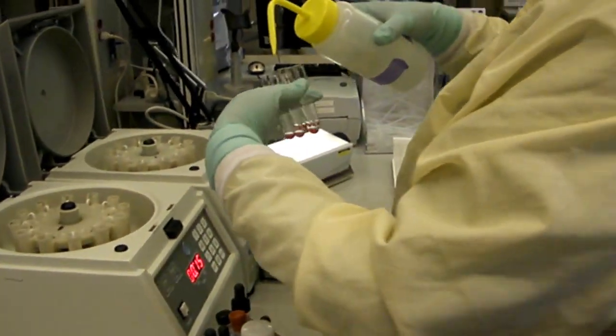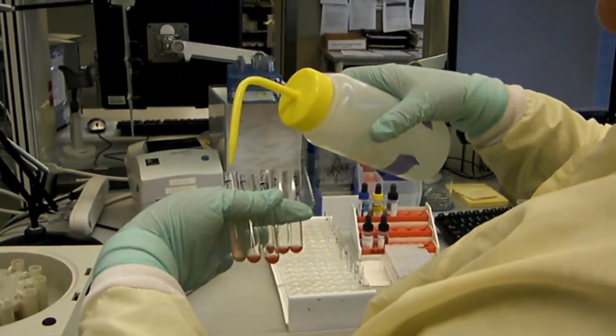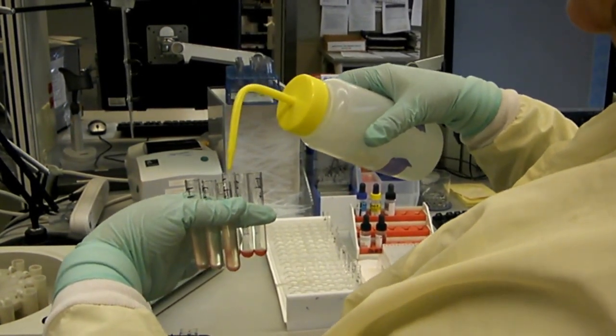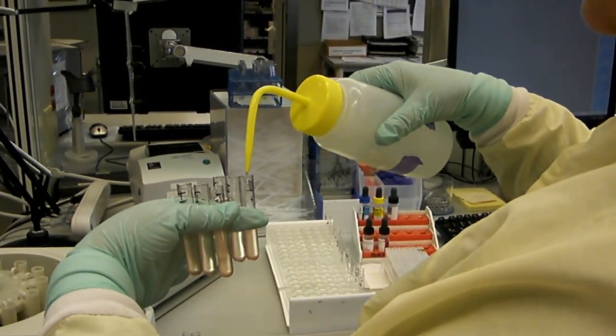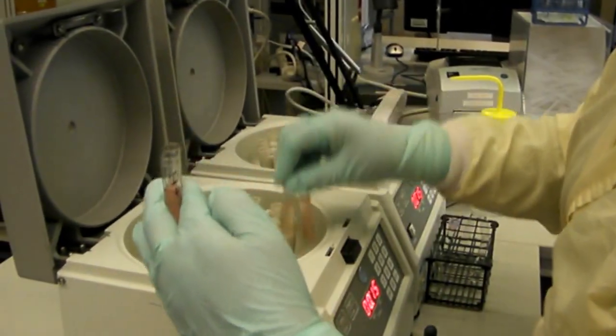She's going to do hand washing where she's going to fill the tubes 2 thirds to 3 quarters full with saline. Now she will spin them for 60 seconds to make a button again.